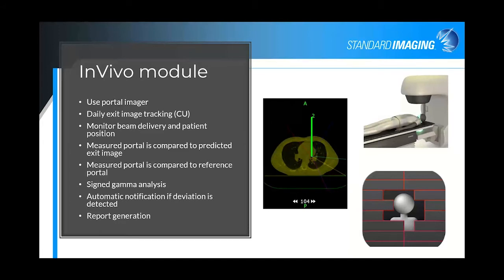One can argue that just because a process exists and is in place to check daily variation, quality improves. This sort of usage, which improves treatment quality, I would argue, is not using this particular module to adapt to change. But trending and weekly average analysis may provide indication for triggering replanning. To illustrate the types of metrics available, I have a few screenshots I'd like to share.